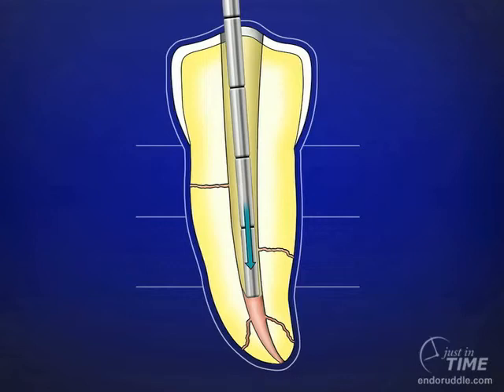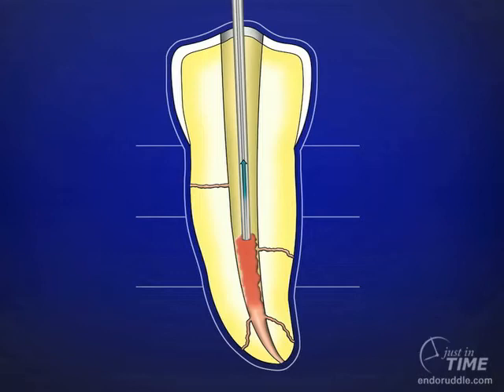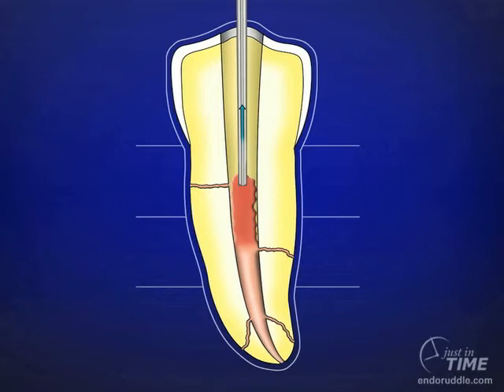This would conclude the down-pack, and we would now be ready to backpack the canal. We can use the Calamus Flow device with the 23-gauge needle — it's quite warm. Place the warm needle on the top of the previously established core and re-thermo-soften the top 2 millimeters. We can now squirt in a little aliquot of thermo-softened gutta-percha. Remove the cannula and, using the pluggers from small to big, step the pluggers circumferentially around the canal. A sustained press for 5 seconds will mold the previously squirted gutta-percha, achieving cohesion with the core established on the down-pack.